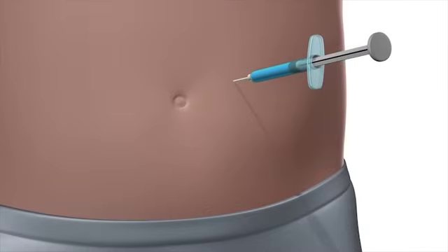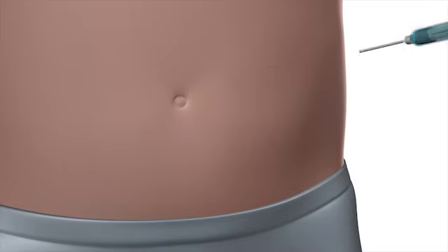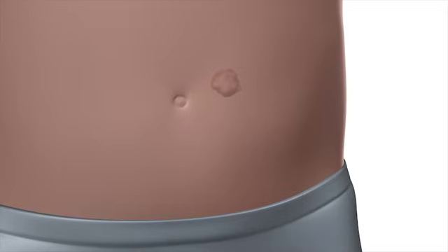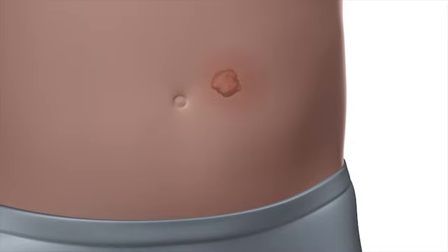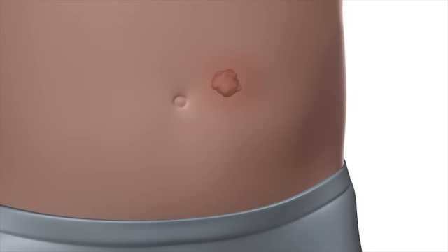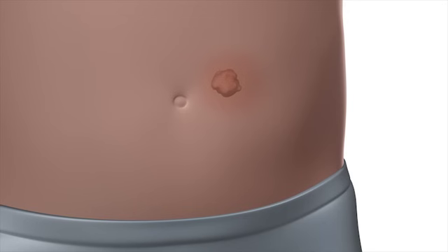If you use the same injection site over and over again, you may get hardened areas under your skin that keep the insulin from working properly. Rotating your injection sites will make your injections easier, safer, and more comfortable.